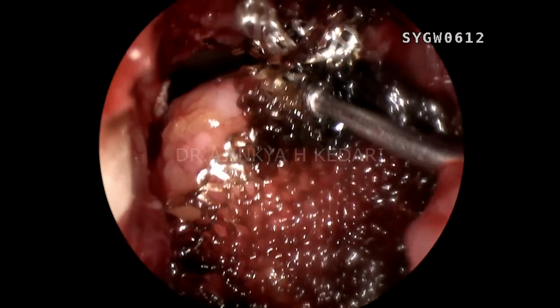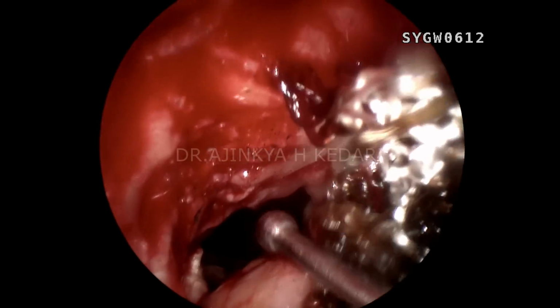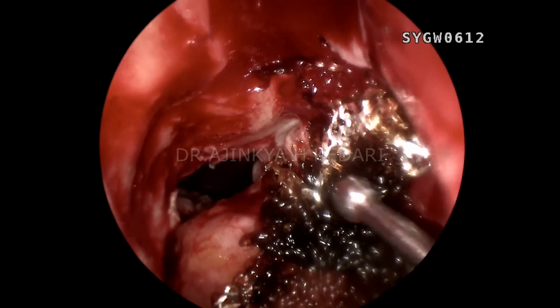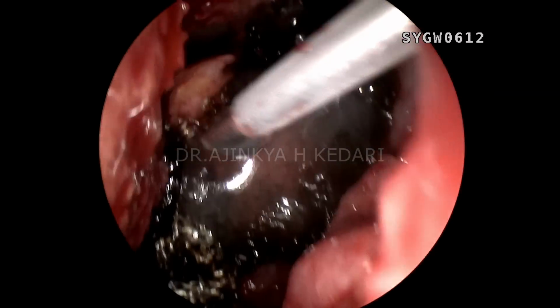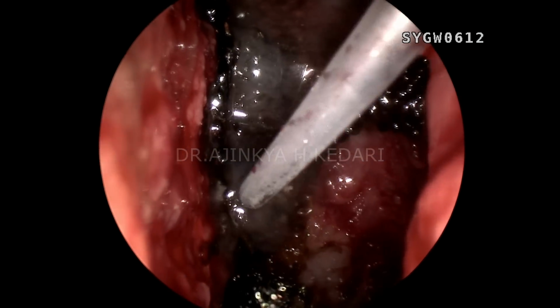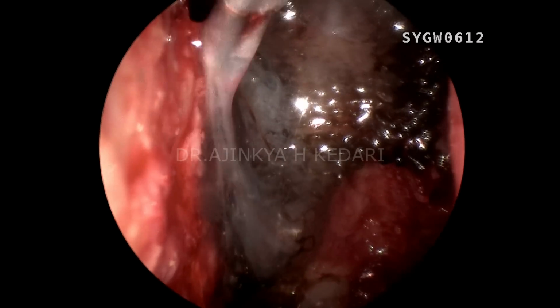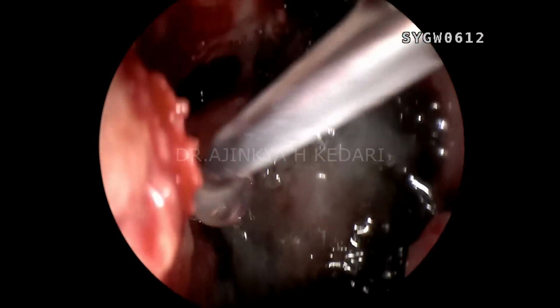Now this is a Surgicel layer over the initial site of the repair, and that's the frontal sinus opening kept patent so that there's no mucocele in the frontal sinus area. Then one more layer of tissue glue just to provide more support. Make sure you do not block the frontal sinus opening. Make sure you do not block the sphenoid sinus opening as well, which was open all this time.